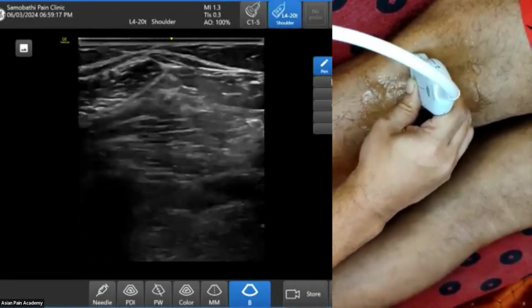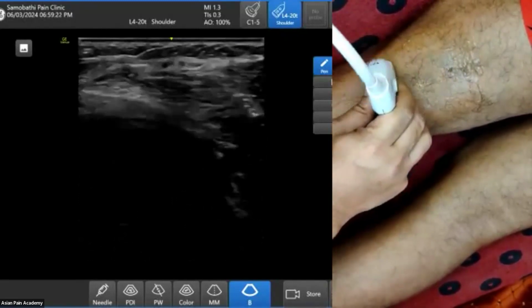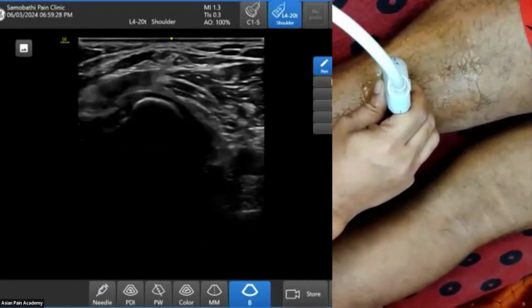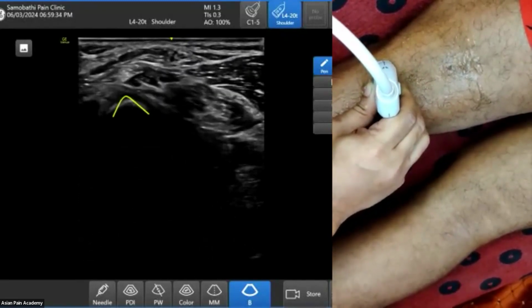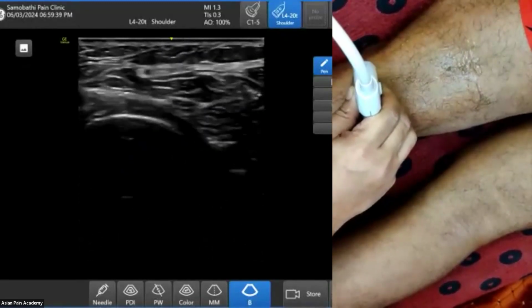Okay. So this is the sciatic nerve. Now if I go laterally, you just see under the yellow. I will keep the peroneal nerve, and you can go up to the fibula also. So this is the peroneal nerve. I'm going down. See the bony architecture. Gradually, it will cross the condyle and it will directly come over the fibula.